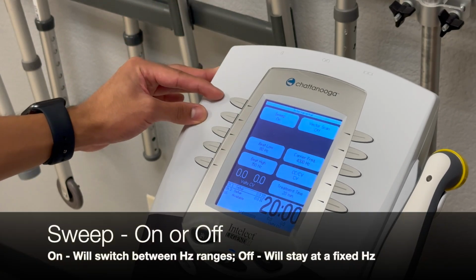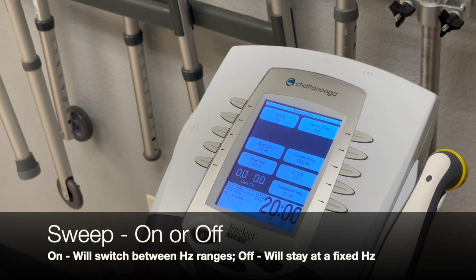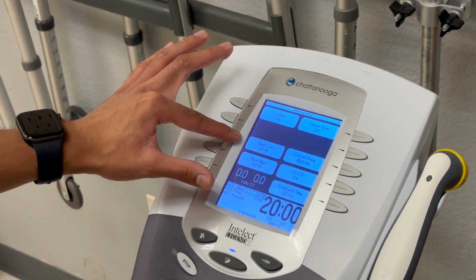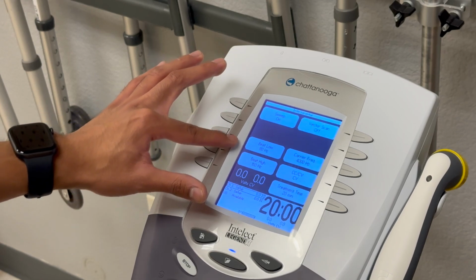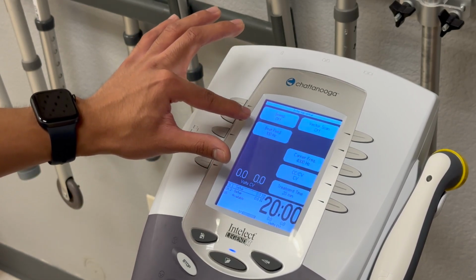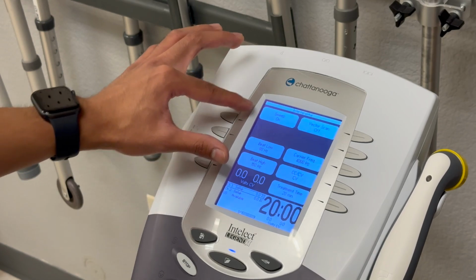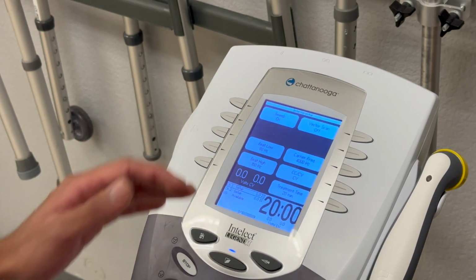Our sweep is on. Turning on sweep is just going to be varying between frequencies or staying at one specific frequency, for beat low, beat high. Sweep is currently on, so this will go between beat low, beat high, between 80 to 150 hertz for frequency delivery. If we have sweep turned off, it will be at a beat fixed where it will constantly deliver at 100 hertz. In this situation, we'll go ahead with sweep on because we're going to be doing opiate release.